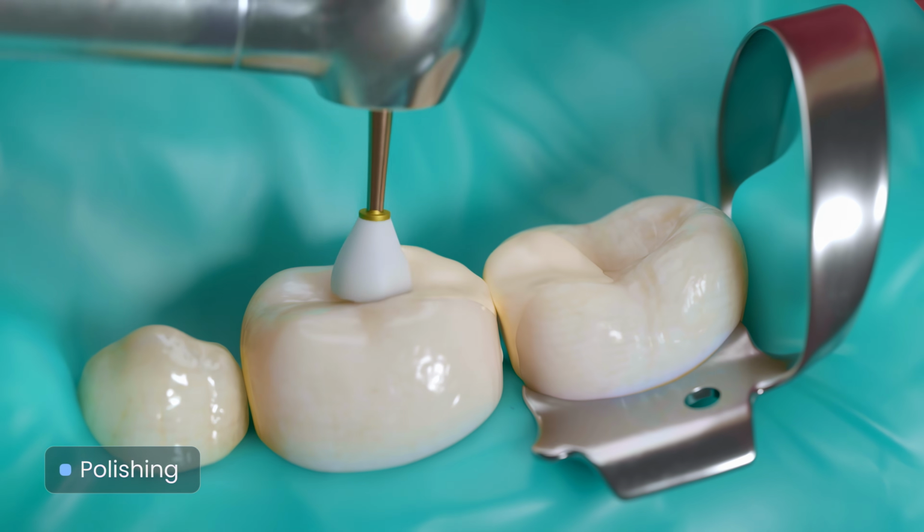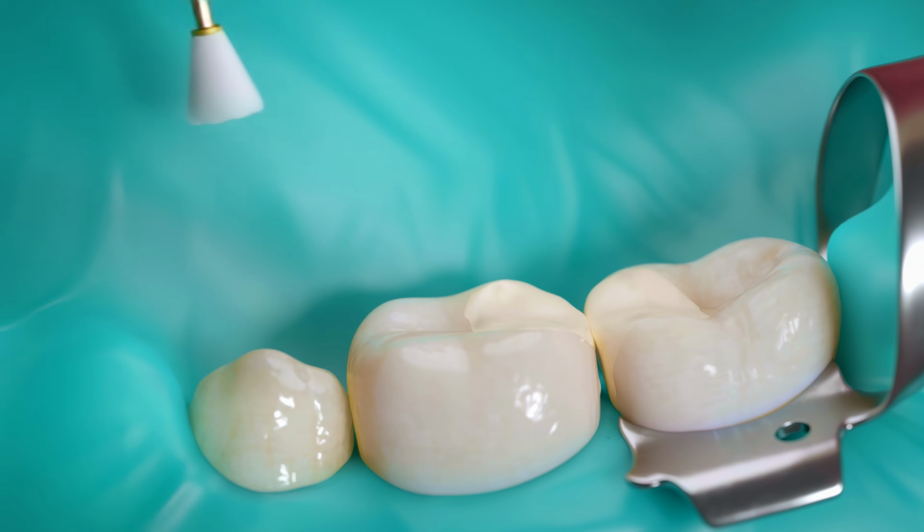Once modeling and occlusal adjustment are complete, all surfaces of the restoration are thoroughly polished.